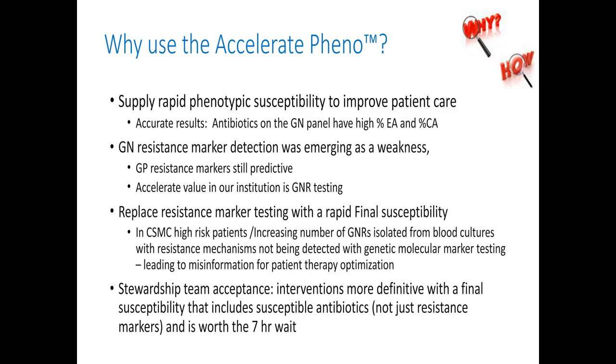So the crux of the matter is that this call can help the stewardship pharmacists with their interventions to assist with antimicrobial optimization, and can help the physician to be more confident that there's not another organism that's lurking in that culture, that they can trust the results that we've produced. So the monomicrobial call is a very, very useful thing to have available to us in the laboratory.